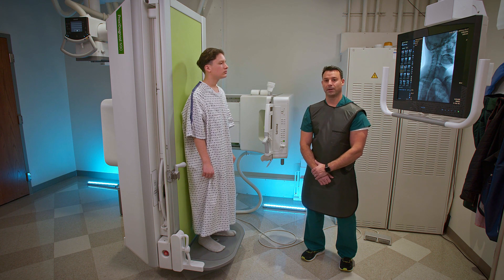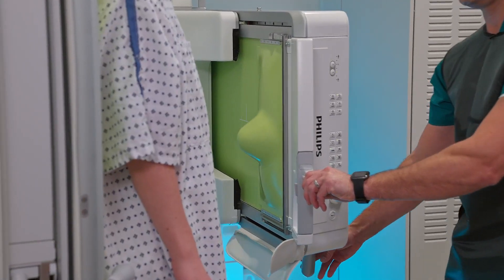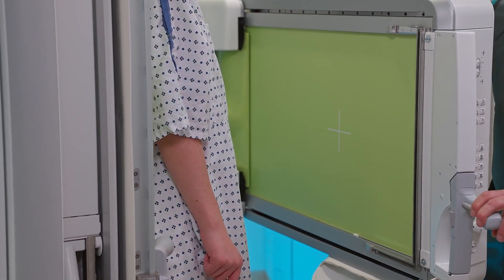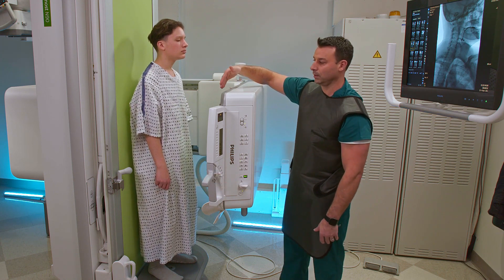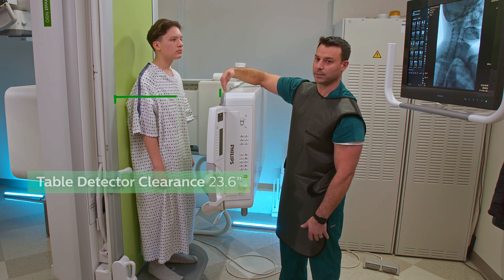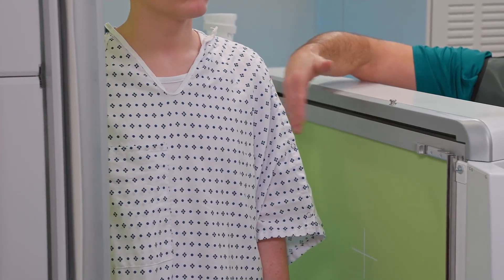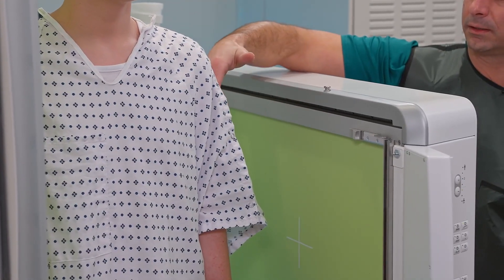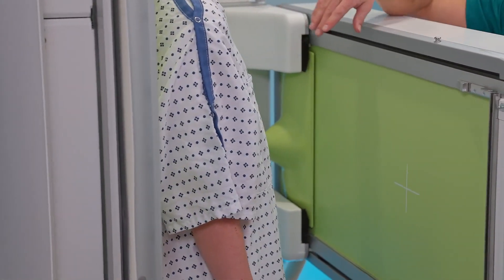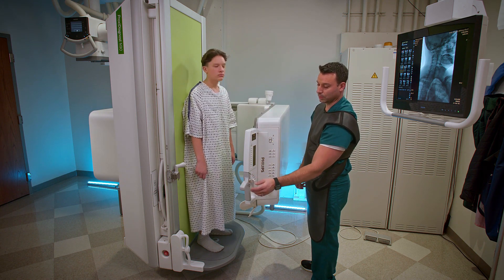Now we're going to demonstrate a modified barium swallow study. We've got our patient on the table. The distance between the tabletop and the bottom of the tower is 23.6 inches, so you have a lot of room to maneuver your patients. You can see there's a lot of distance from the bottom of the detector, so you can easily get large patients in here sideways. Then I can move this down and bring our radiologist in to do the fluoro portion of the study.